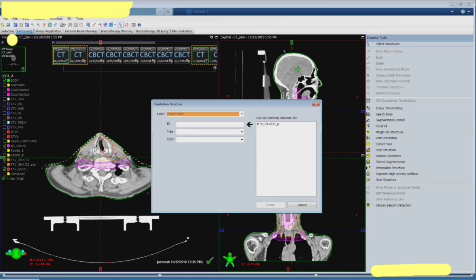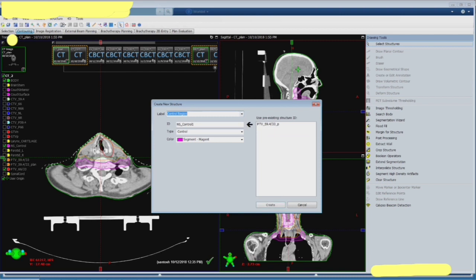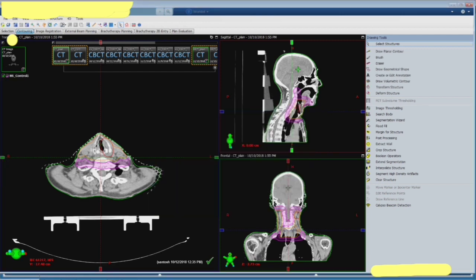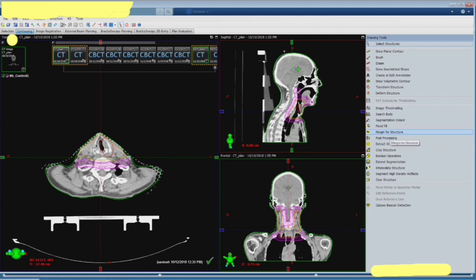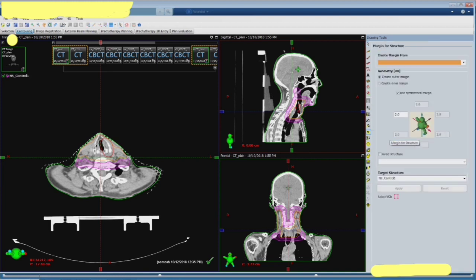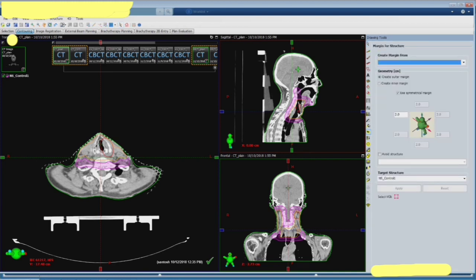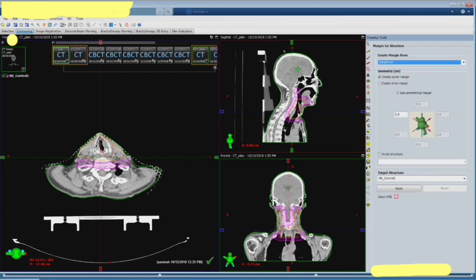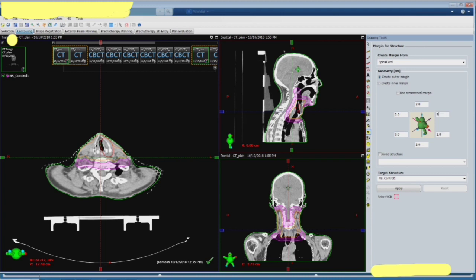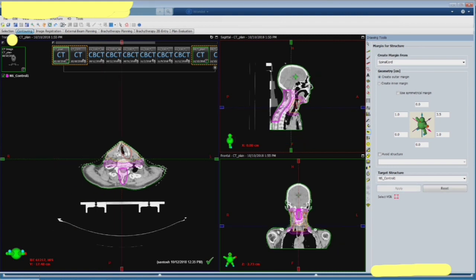Posterior neck, that's important. So I'm going to create the volume. I'm going to take a spinal cord as an initial thing. So I'm going to give the margin to the spinal cord anteriorly zero and posteriorly it's about 3.5 centimeters. It's up to you I mean.